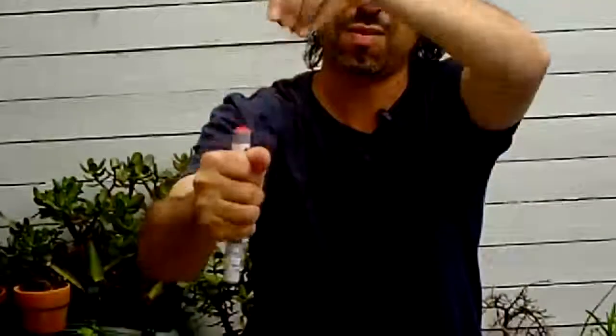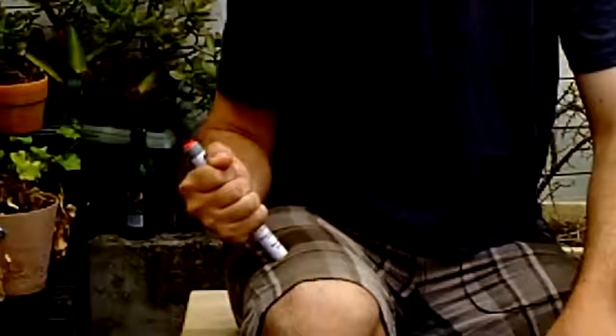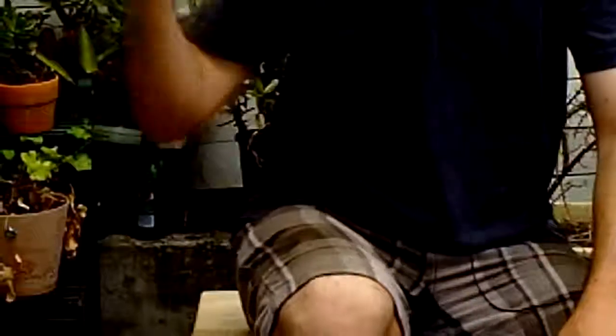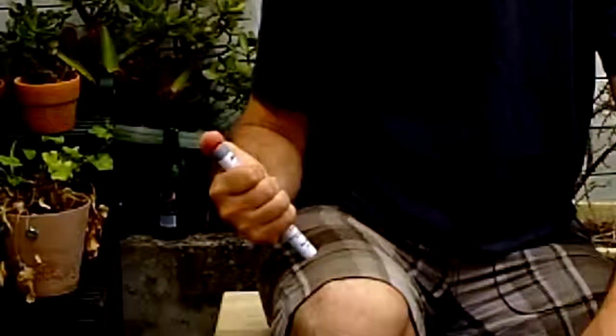You have the needle end pointing down because you're going to strike this into the upper thigh of the individual. Take the black cap off the end and put that aside, still grasping with your hand so you're not turning it up and down. Then take the grey clip off the top. You'll see there's a red button on the Anapen, and then it's simply a case of placing it onto the thigh at a 90-degree angle. This is a push-button device — you don't have to jab it. Place it onto the thigh in its proper position and reach up with your thumb.